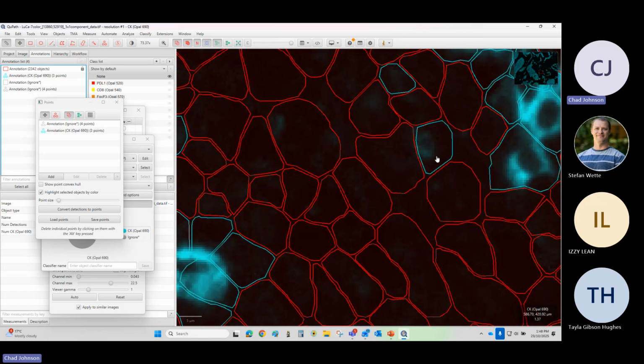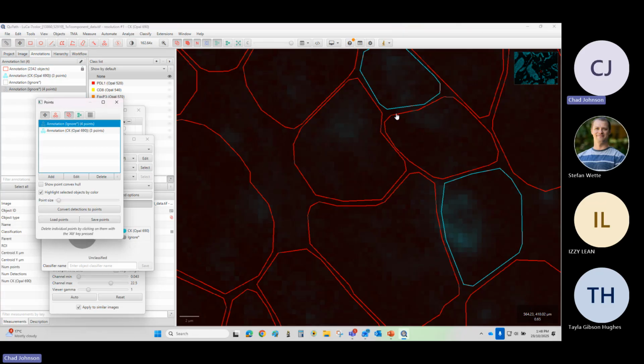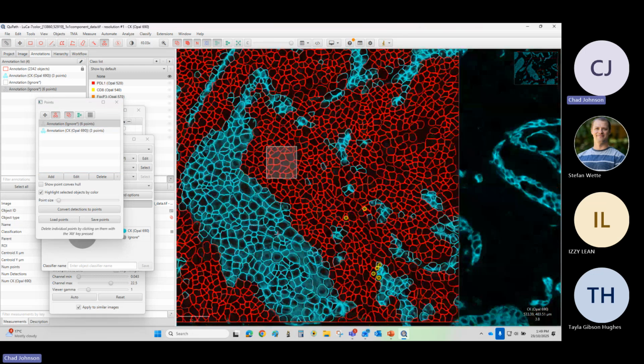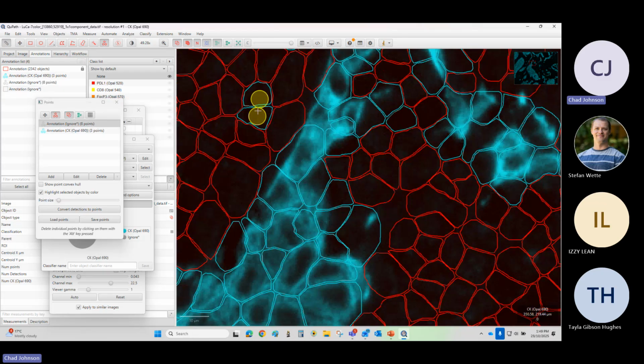So here, that's probably positive, but that's mostly negative. So I'm going to go ignore, ignore. There we go. And again, more is more. The more you add, the better your algorithm is going to be.